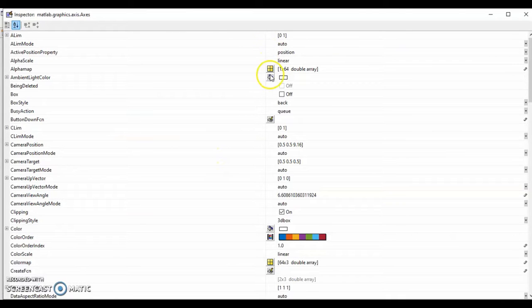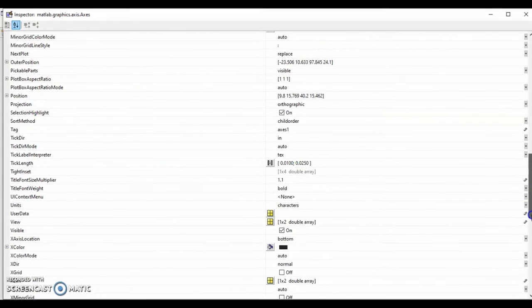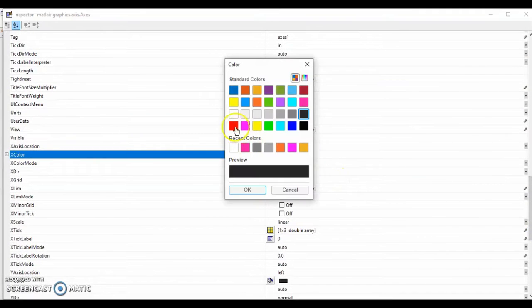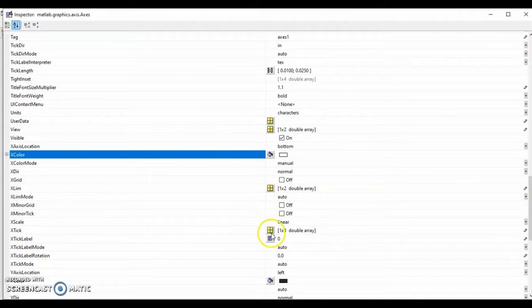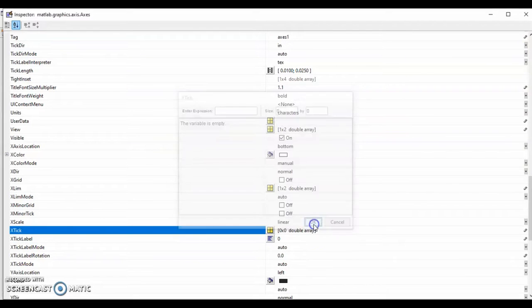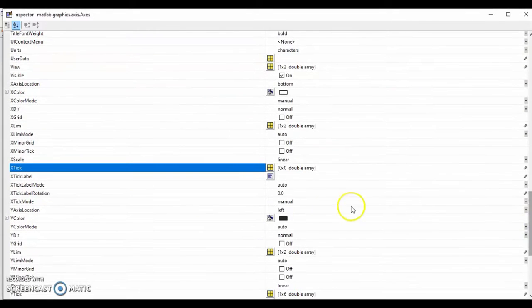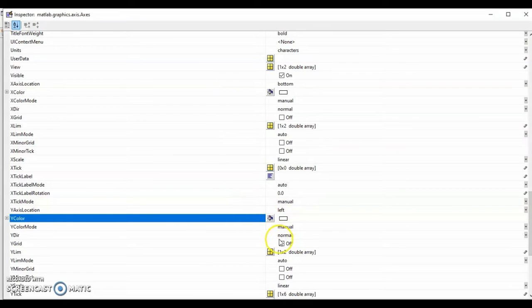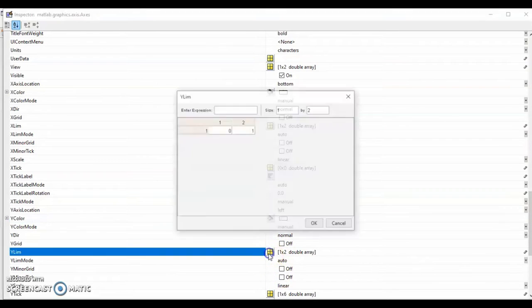So double click the graph axis to adjust the parameter, and we will change the color of X and Y axis to white color. Next, we will remove the column and row of the graph axis by changing it to 0. This is the same for both X and Y axis.